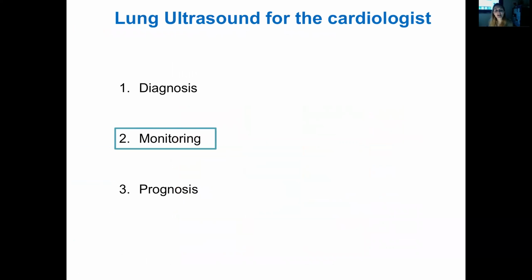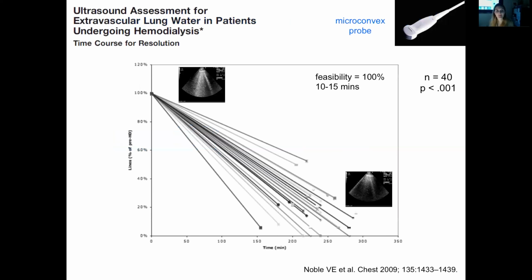Okay, so we have done our diagnosis, but now we still need the lung ultrasound for monitoring our patients. And I think the monitoring is maybe the most exciting part at the moment, because there are a lot of papers coming out, and we are really starting to see how it can be useful in our patients.